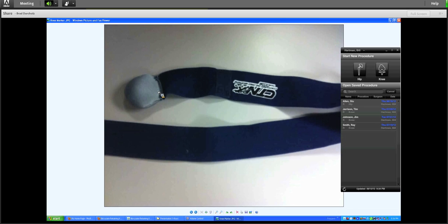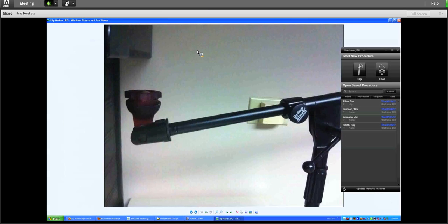The other piece that we're looking at, and this one is still a little bit up in the air, is some sort of stand mechanism that this 25 millimeter sphere will fit on the end. The idea behind this is a lot of times the patients are heavy enough that if you try to feel the greater trochanter, there's enough tissue, and it's really hard to get the ball into the field of view because of the patient's tissue off the side of the greater trochanter. But you can use the greater trochanter to get your relative position.